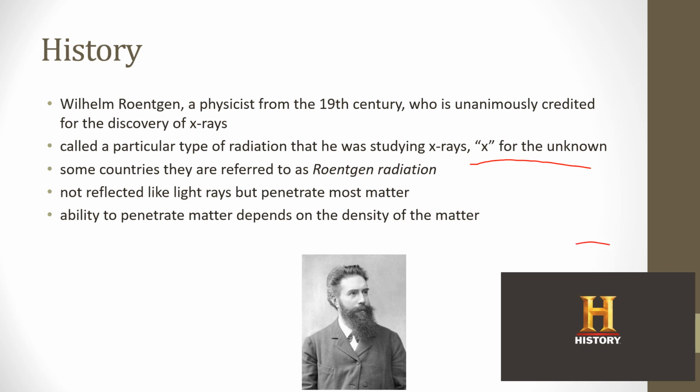So let's say I have this really dense, thick brick here, and then I have all these X-rays that we're just going to shoot at this, and then I have the X-ray film back here, or nowadays it's a cassette, but I have the film. Because it's so dense, will the X-rays be able to get through that material very easily and hit the film? No. So hardly any of them will go through there, and therefore that's going to be very opaque or white. It's going to be very dense.